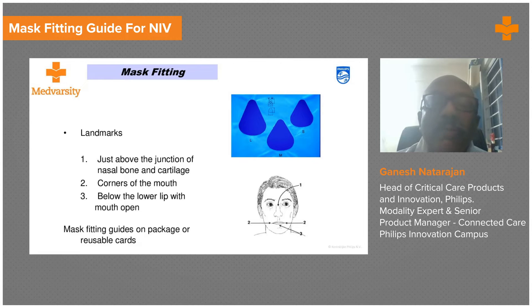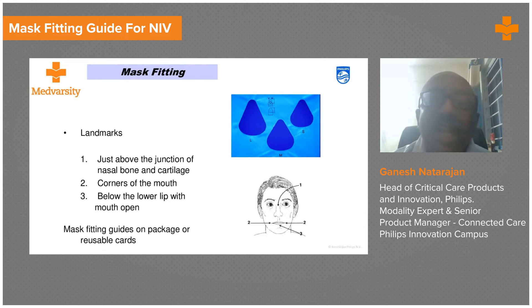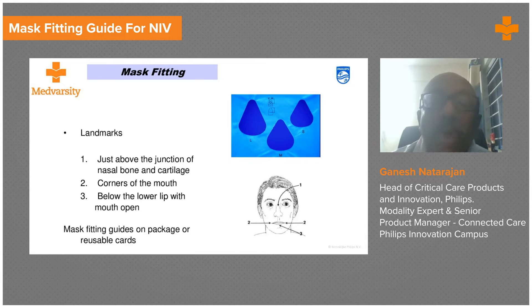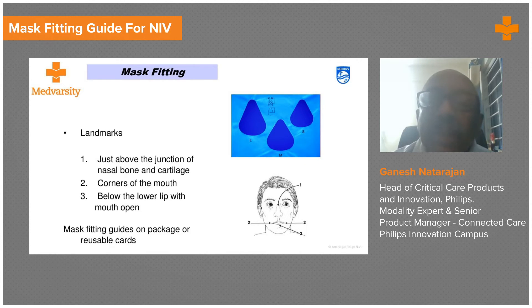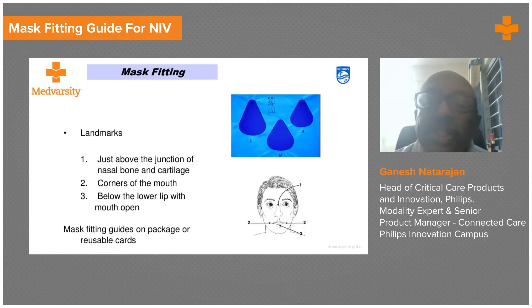All masks come with a mask fitting guide and indicators to help choose the right mask. Masks come in three standard sizes: small, medium, and large, with indicators matching the nasal bridge, nostrils, and below the lips. A key tip used by RTs in the ICU is to keep a variety of masks available so that if a patient is uncomfortable with one, they can immediately switch to another, since mask discomfort is one of the largest risks of NIV failure.